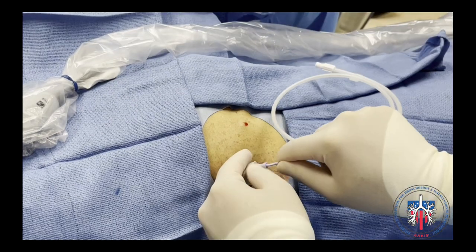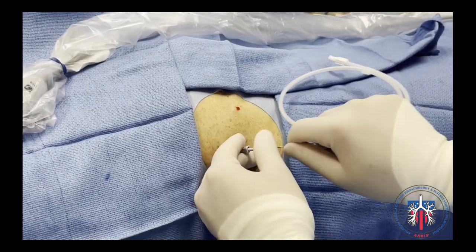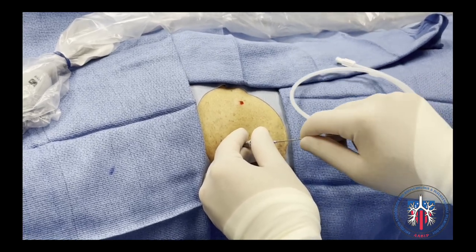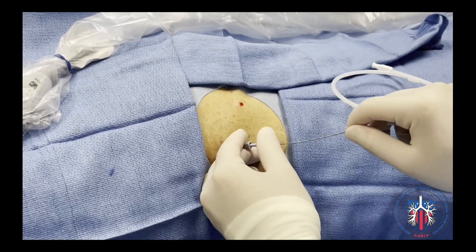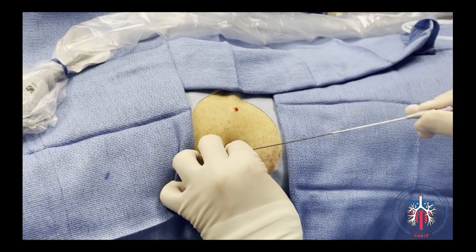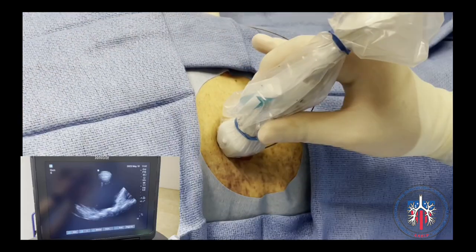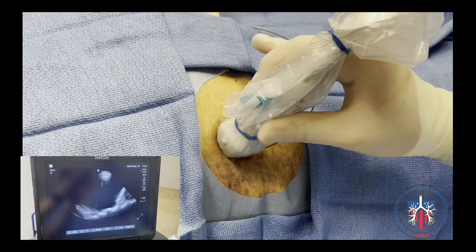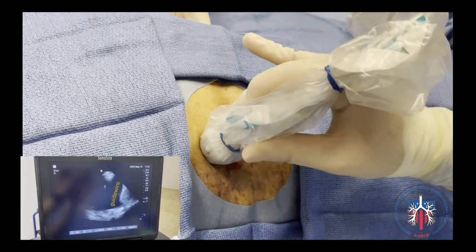The J-tip guide wire is then inserted via the catheter into the pleural space. Be wary of any resistance when inserting the guide wire. If there is significant resistance, remove the guide wire and repeat the previous steps of accessing the pleural space with the finder needle. After the guide wire is inserted, the catheter is removed over the guide wire. Although not required, ultrasound can be used to confirm that the guide wire is positioned in the pleural space. Here we can appreciate the guide wire within the pleural space in this ultrasound image.